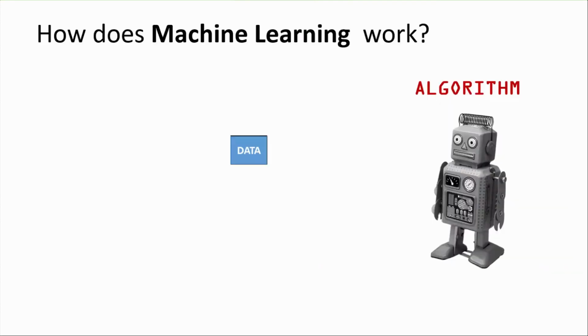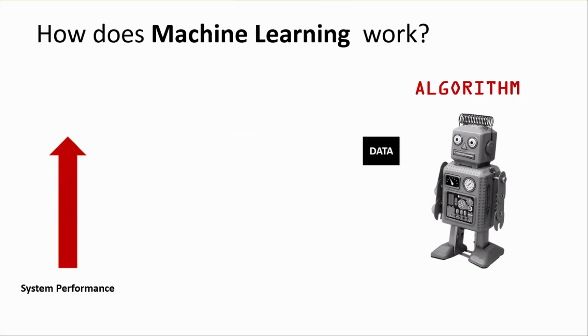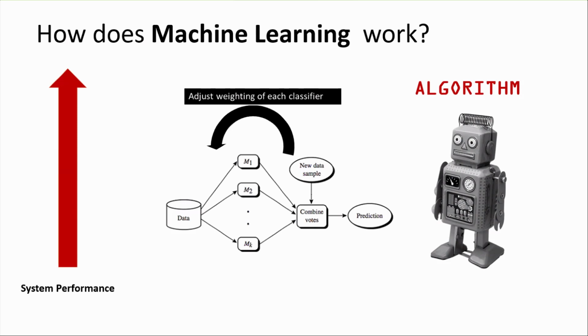And the beauty of machine learning is actually that the more data you give these algorithms, the greater the system performance. They get cleverer and cleverer and cleverer. And based on new data, they adjust up and down the algorithm weights to increase their accuracy and prediction. And the same cannot be said of humans. Humans have a learning curve, yes, to begin with. As they do more and more and more, they get better and better. But then they also get more and more fatigued and tired, and there's a limit to that learning curve. Not the same for machine learning.